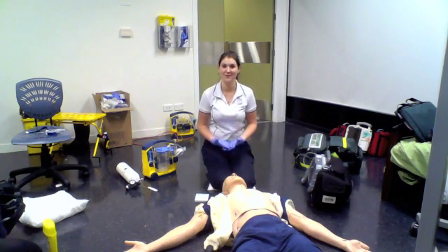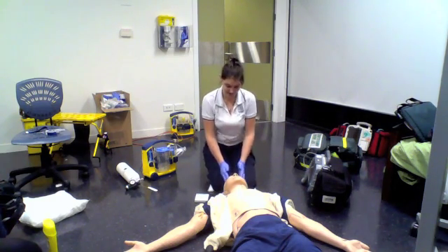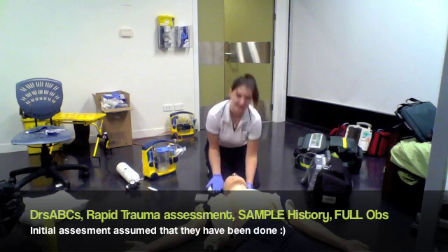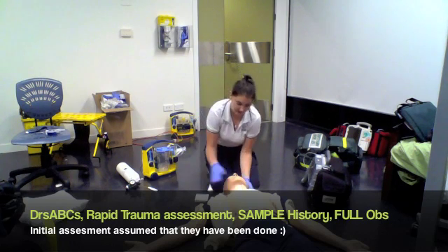I'm suspecting my patient has a TBI. He's had a fall, he has a boggy patch on the back of his head. He's got a decreased GCS. The first thing I'm obviously going to do is my ABC, so looking in the airway, is it clear, is there vomit, blood, whatever. I've got the suction unit right here with me if I need that.